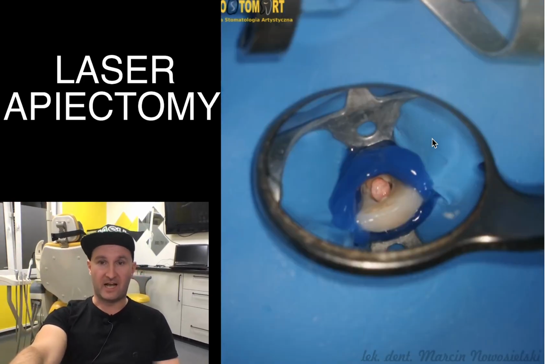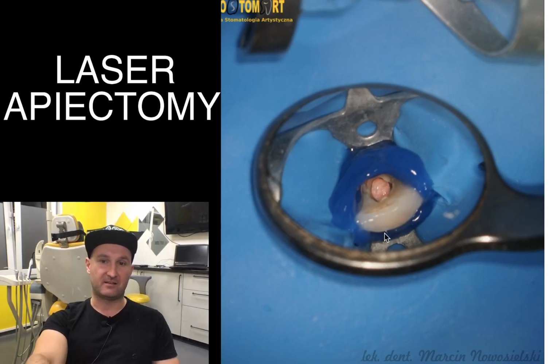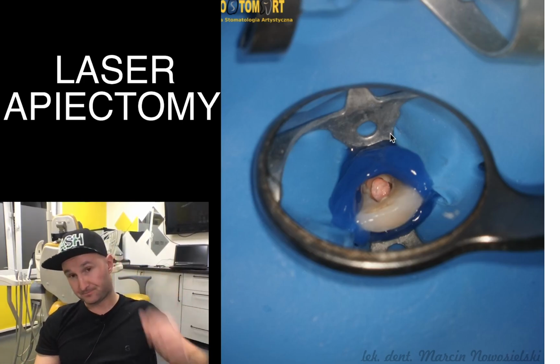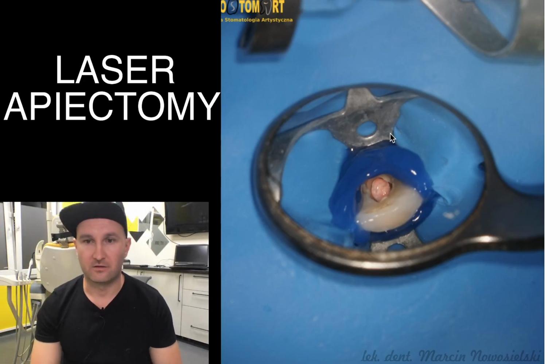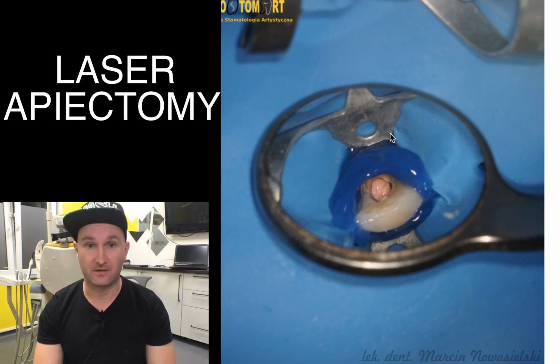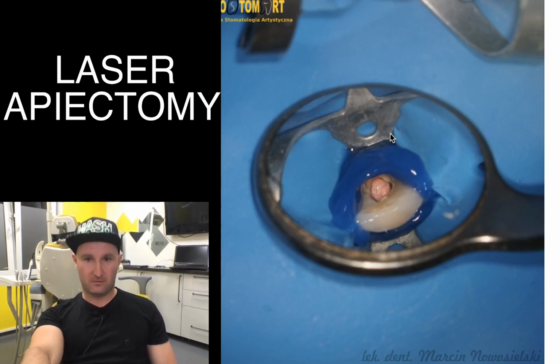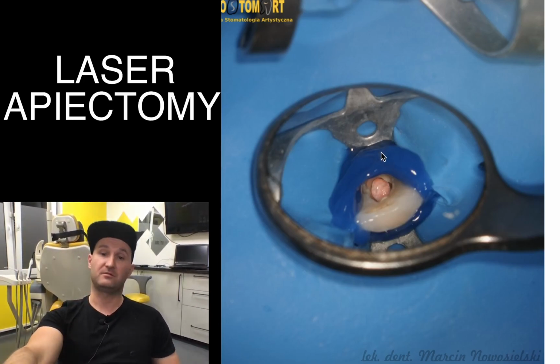Then we isolated additionally entire field with the liquid rubber dam, which led us to improve our isolation, which is very important in case when we use laser activated irrigation, because in this case irrigant can flow everywhere, even under the rubber dam. So this perfect isolation is very, very important.